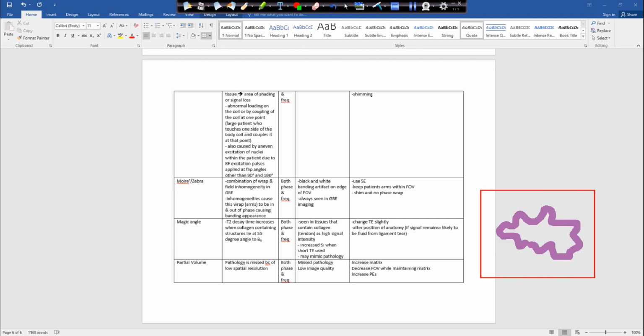So to improve this and maybe see this particular pathology, we now increase our matrix. Even though we're still averaging these together, where you'll have an edge of pathology and then mostly just normal brain tissue, this will give us a certain shade of gray.